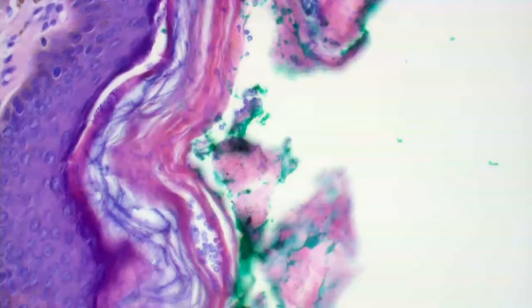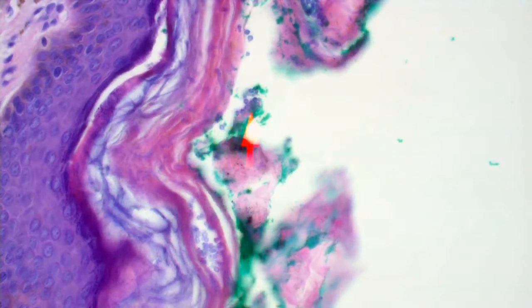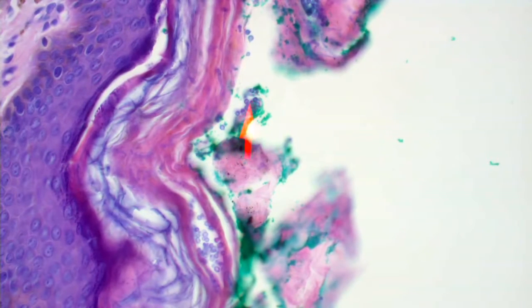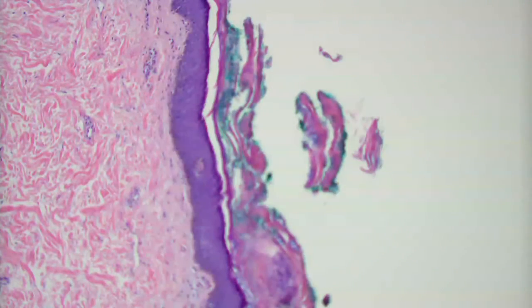Notice how large these hyphae are. They're very large, much larger than the hyphae of a dermatophyte. And you don't see these kinds of spores in a dermatophyte. You might occasionally see some chlamydospores, but you don't see these larger spores. These clusters look almost like grapes. So this is tinea versicolor. And Corynebacterium would be much smaller. Much smaller. Yeah, they're very, very tiny.